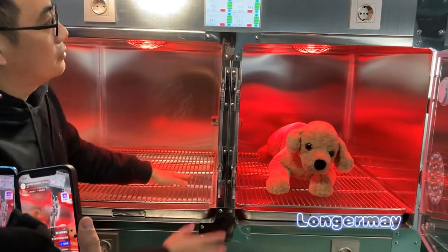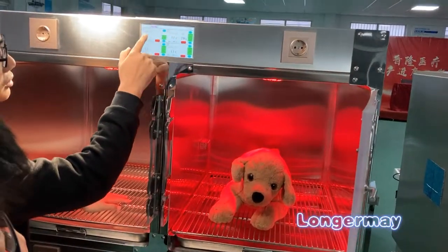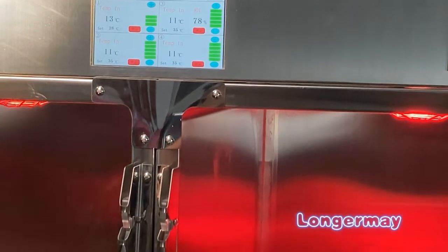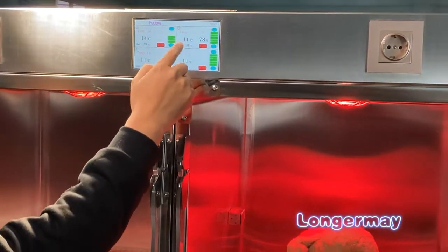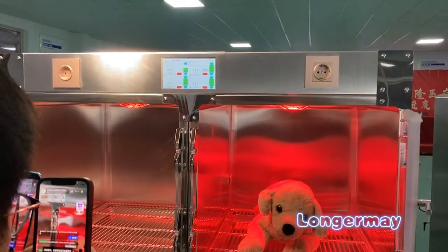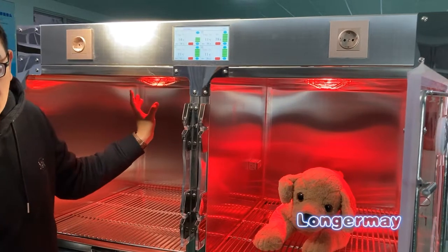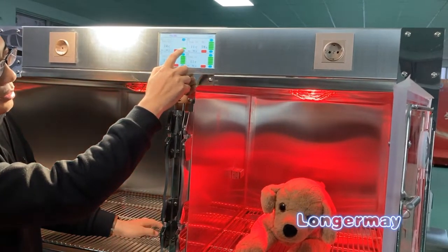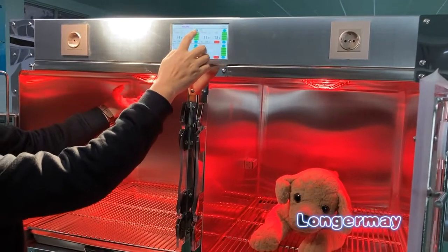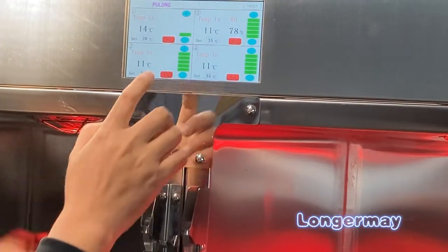This one. And now you can see the temperature. I just set, and now it goes up. And the others keep the same temperature. And you can see that we can also adjust the brightness of the infrared light. You see? Now this is the five step. Yeah, it is adjustable.